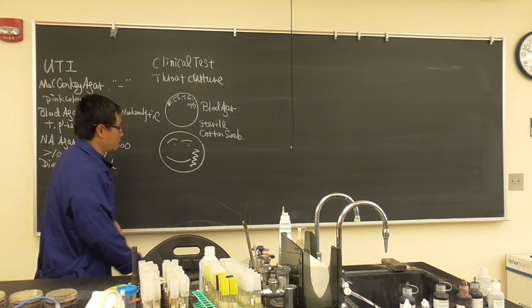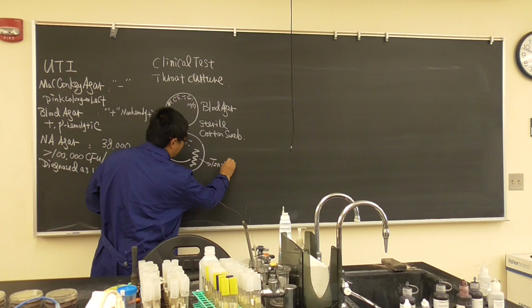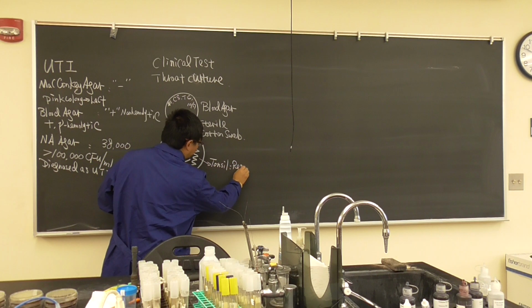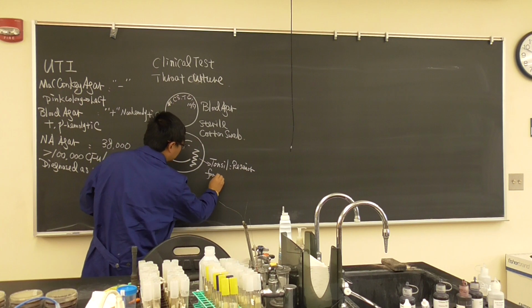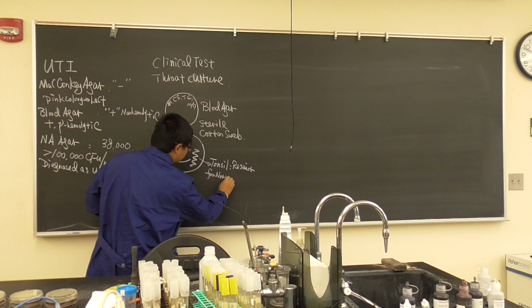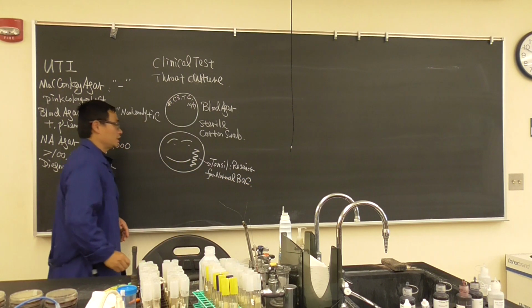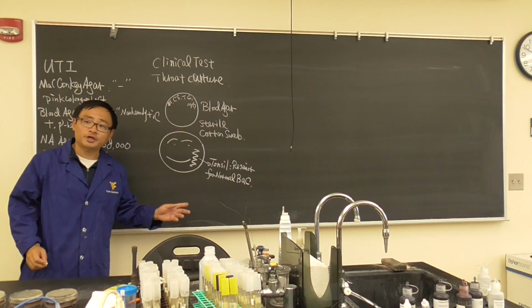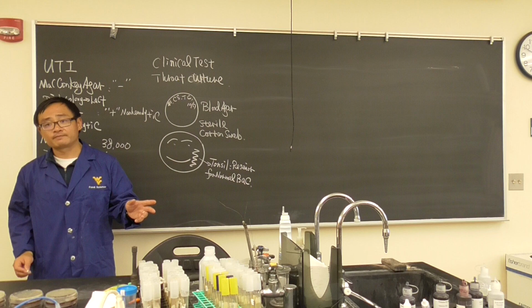This tonsil area will be a very good reservoir for normal bacteria. And today we want to test what kind of bacteria it is.